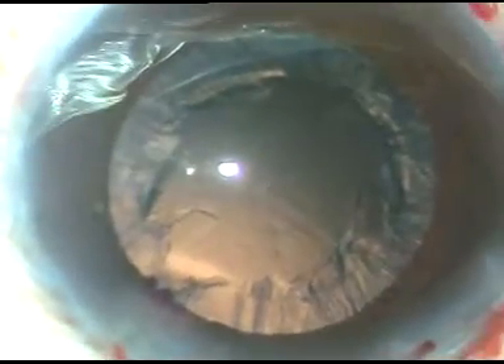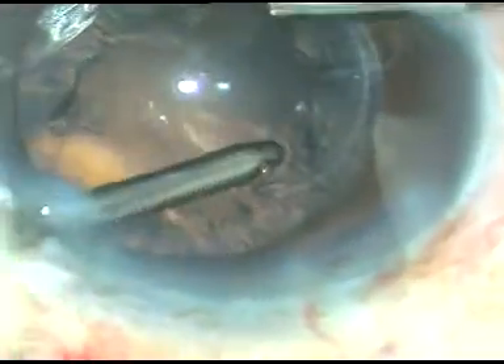This has been termed 'natural hydro-dissection' by Dr. Narayan Bhardali. He is a great teacher — I respect him so much. He is the founder of Chandra Prabha Eye Hospital at Jorhat, Assam. The nucleus has been removed. Now there is a lot of lens matter remaining in this case, and I am going to use bimanual irrigation-aspiration to remove the cortical lens matter.